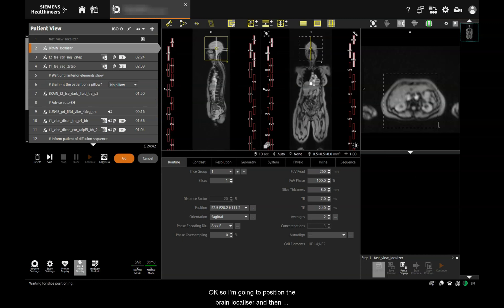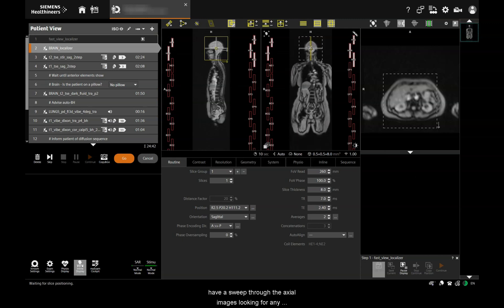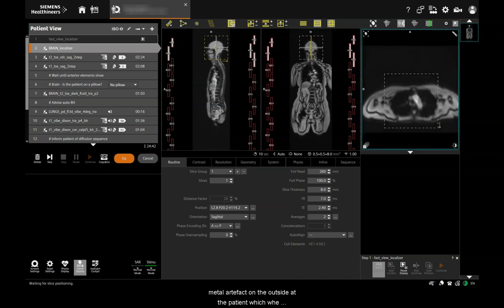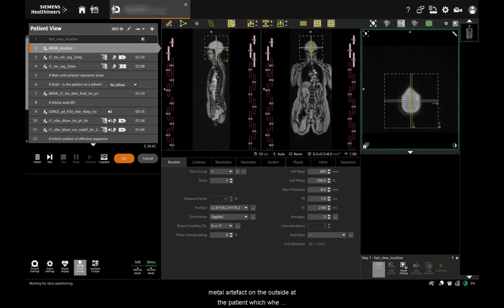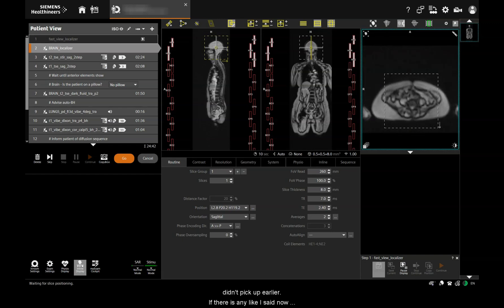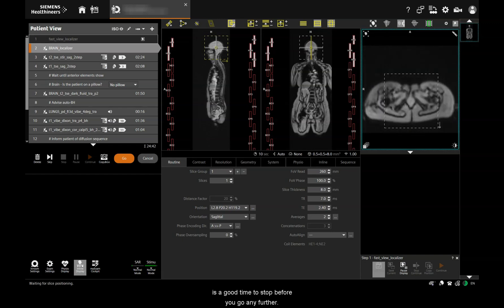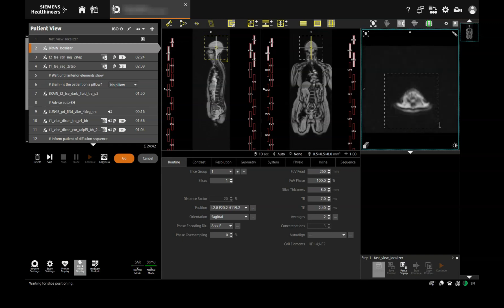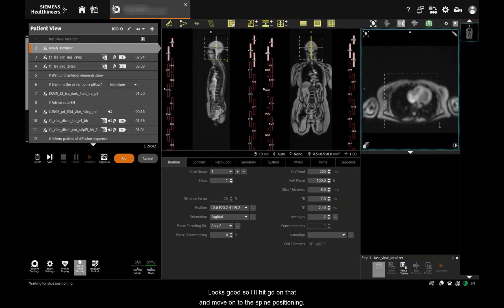I'm going to position the brain localiser and then have a sweep through the axial images looking for any metal artefact on the outside of the patient which we didn't pick up earlier. If there is any, now's a good time to stop before you go any further. Looks good, so we'll hit go on that and move on to the spine positioning.